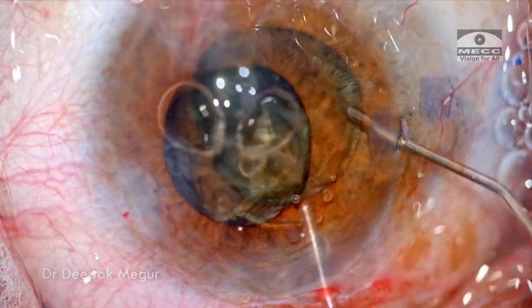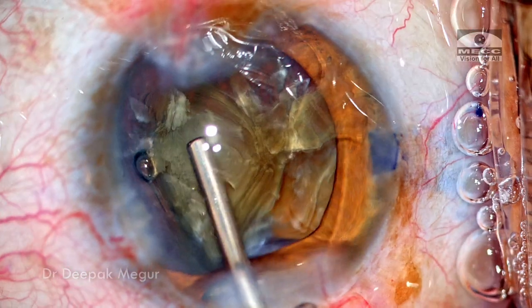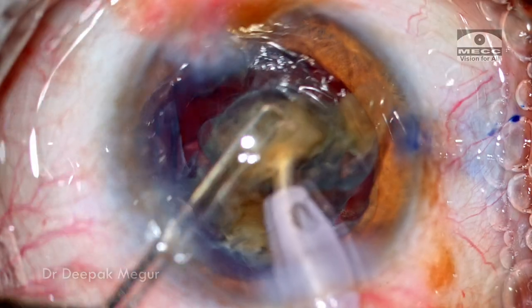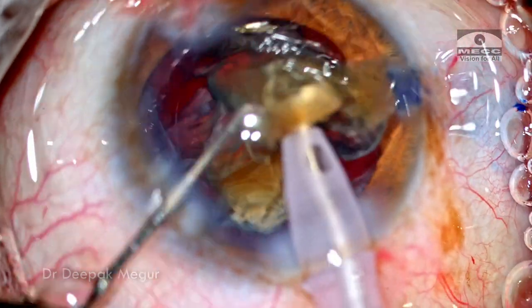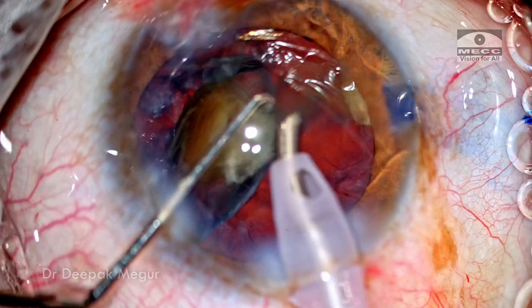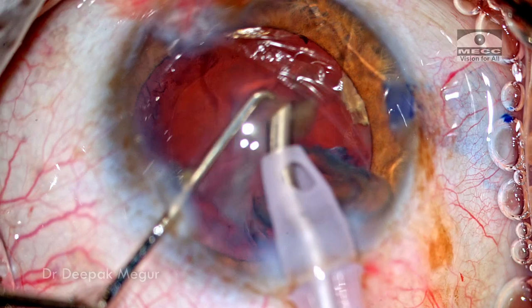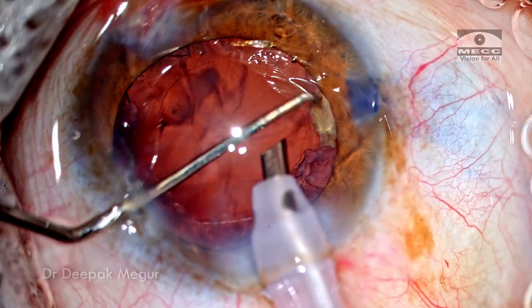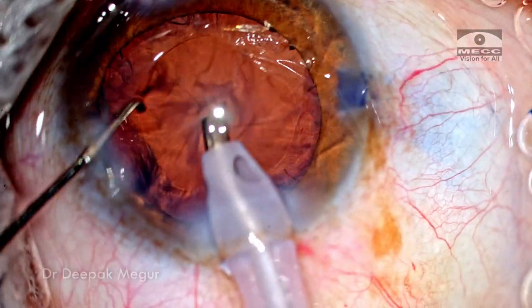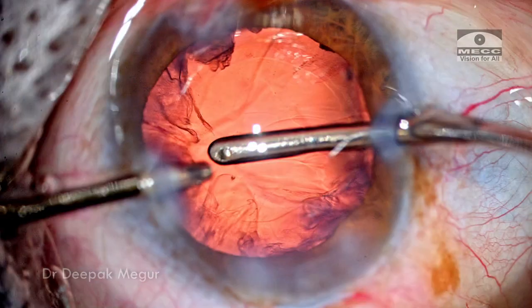OVD is replaced back to ensure the endothelium is adequately protected, then the phaco is reintroduced and each of these fragments is slowly and steadily emulsified in a very controlled manner. The last fragment is emulsified quite easily. Nucleus emulsification is done and over — time to deal with the cortex.